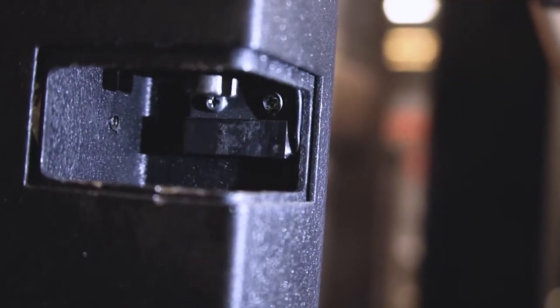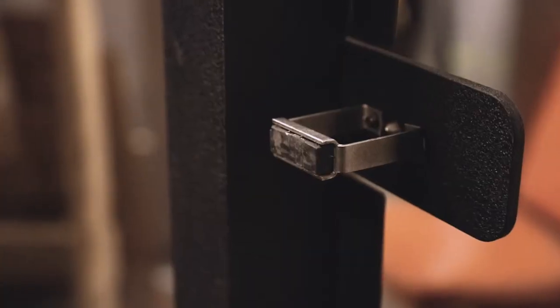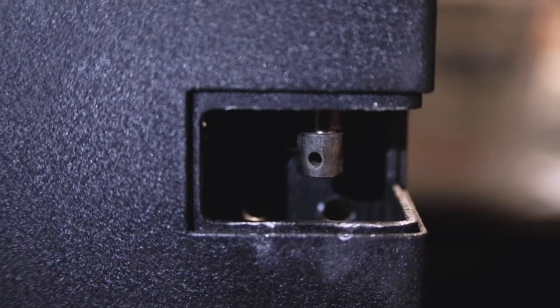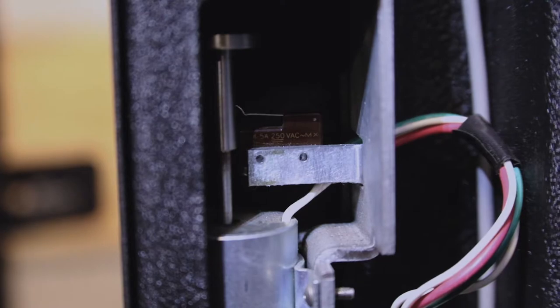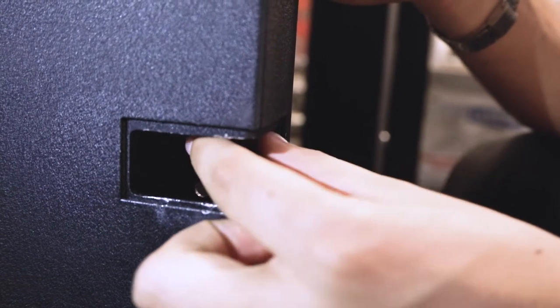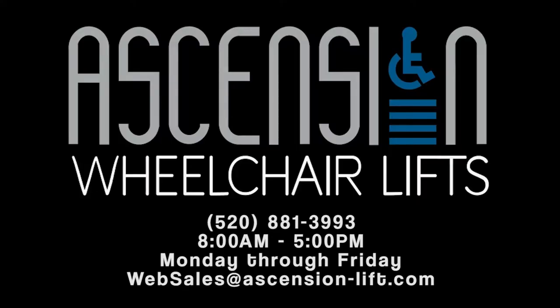For this type of interlock, the magnetic switches mounted at the back of the strike side cutout must sense the magnet attached to the end of the actuator for the lift to think that the gate is closed. Additionally, when attempting to run the lift, the silver solenoid locking rod must drop and depress a switch hidden above for the lift to think that the gate is locked. On occasion, the rod can get sticky and will stay up even when the solenoid is not actively holding it up. Oiling the top of the rod can help with this. Contact Ascension if you need the instructions for performing this maintenance task.